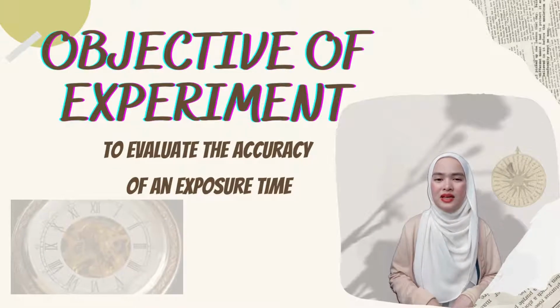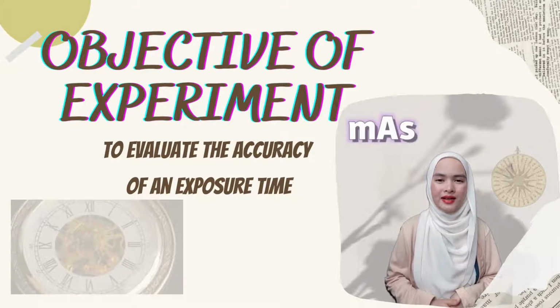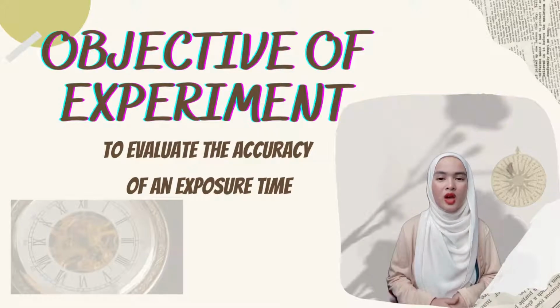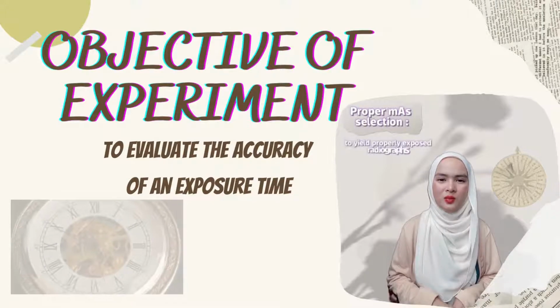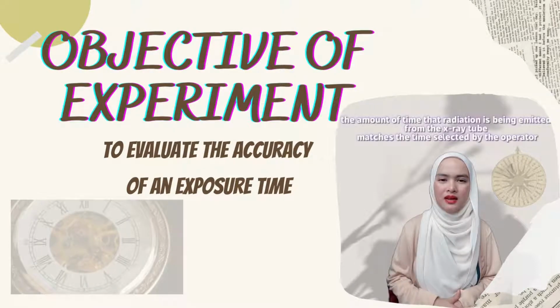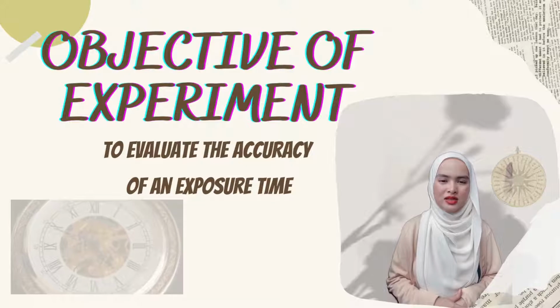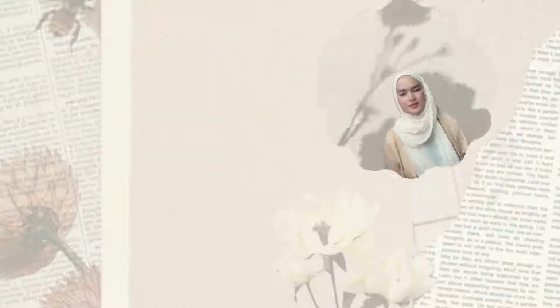The selection of milliamperage (mA) and exposure time, collectively known as mAs, directly affects the total quantity of radiation produced during an exposure. Proper mAs selection is one of the most effective ways to yield a properly exposed radiograph and reduce patient dose. It is then important to make sure that the amount of time that radiation is being emitted from the X-ray tube matches the time selected by the operator. Therefore, it is critical for the exposure timer to be accurate and properly calibrated.